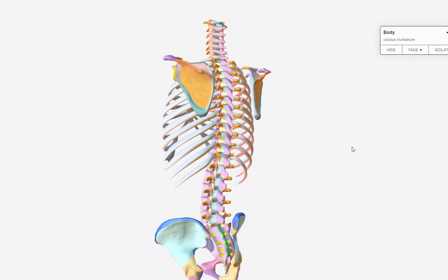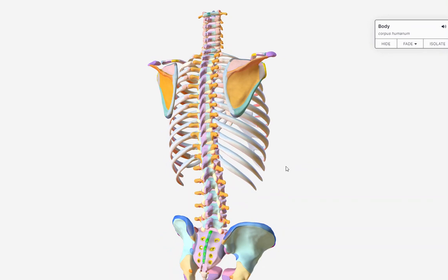PA projection. The x-ray has to enter the patient's back, and cross through their body to get to the table or the bucky. It's going to exit their anterior side. So the name of the position, this position here, is RAO, right anterior oblique, with a posterior anterior projection. Projection is the path of the beam. The projection does not name the position of the body, okay? All right, so RAO, PA projection. LAO, PA projection. All right, so now let's turn our patient around.